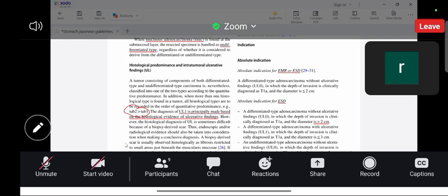So if we can clinically differentiate it, then it's okay. If we cannot discriminate, then we have to depict it as UL1, ulcerative lesion type 1. In biopsy-derived scar, fibrosis is restricted to a small area just beneath the muscularis mucosa because we target the mucosa mostly.